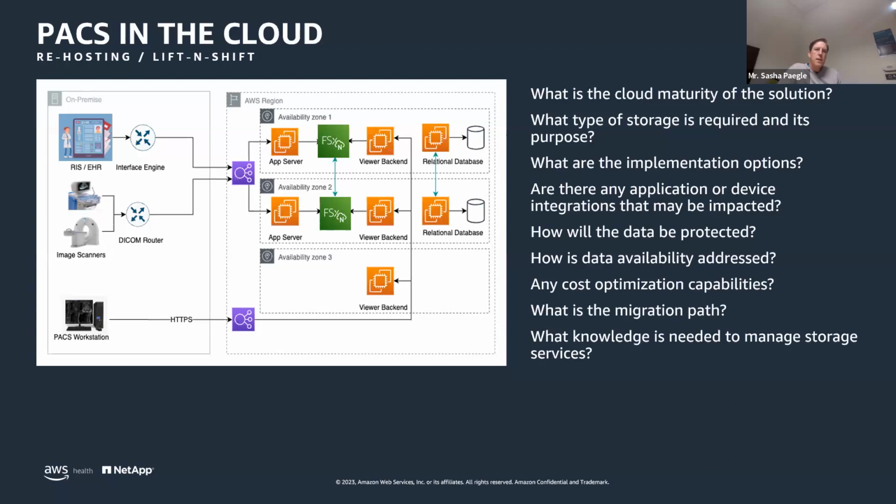The other area you would want to investigate is how we would actually implement this. How would we migrate all of our images into this cloud solution, relative to our existing on-premise applications? Again, this is an area you want to dive into, because you may be able to parlay your existing experience with your current storage technologies, because they may offer native capabilities to make that migration simpler and easier.